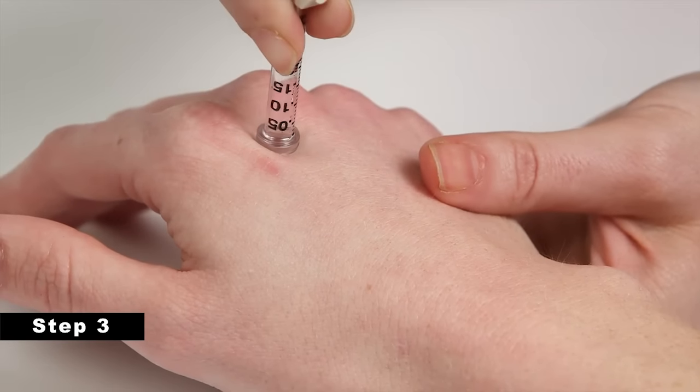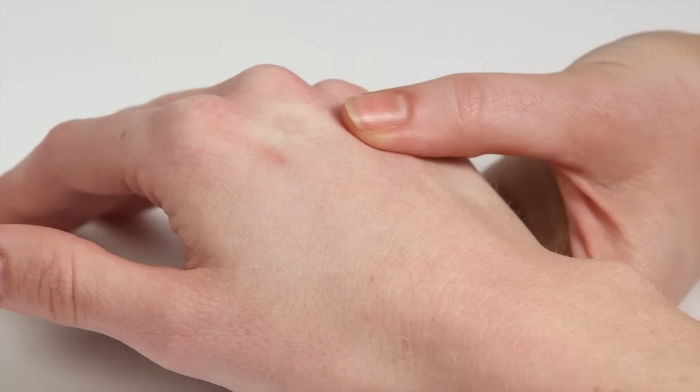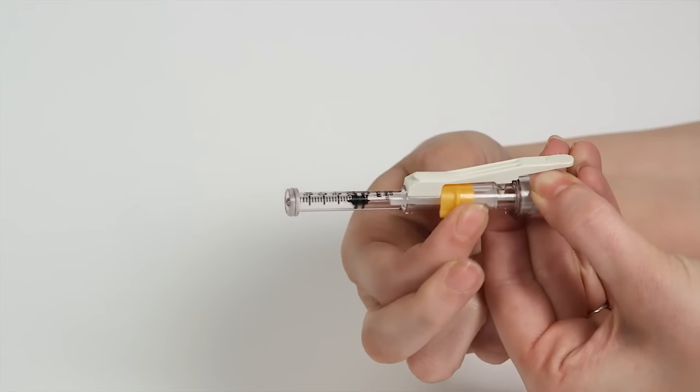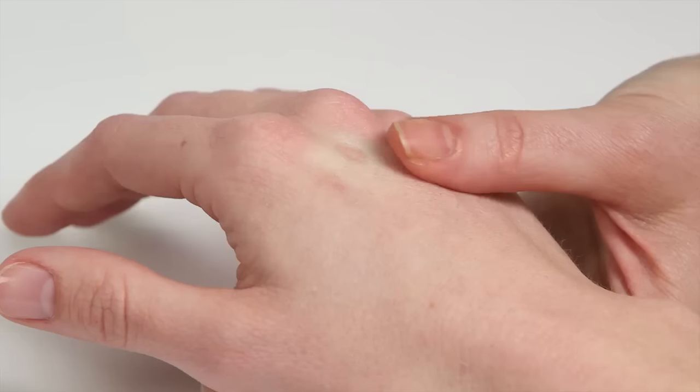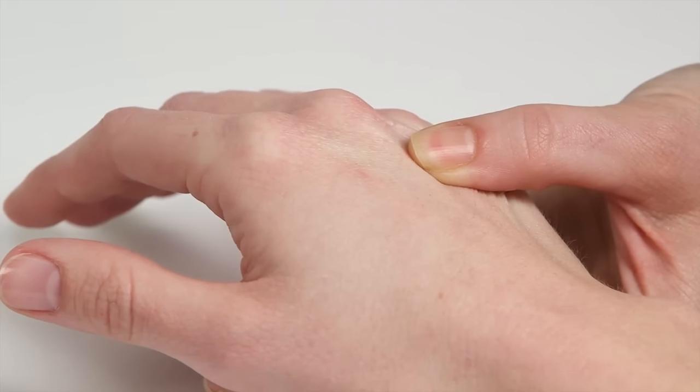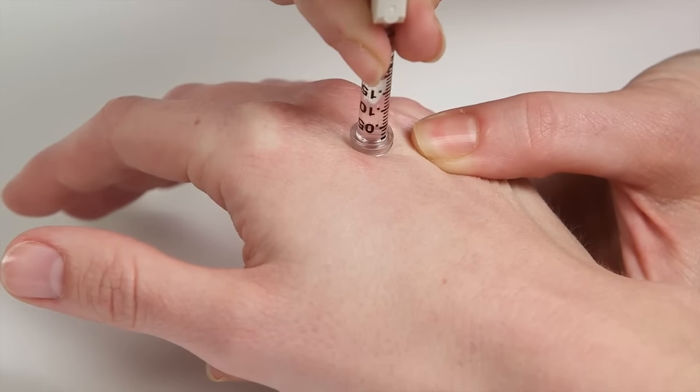Step 3. If the injection is to be used near a vein, then the Z-Track method is recommended. The method begins by making sure that the skin is relaxed. Then, make a bullseye using the J-Tip to mark the injection site. Next, remove the orange safety by pinching each side. The skin then should be manipulated, moving the bullseye to the desired location away from the vein and placing the J-Tip back on the mark. If the vein rolls with the skin, do not use the Z-Track method and instead, inject to the side of the vein.